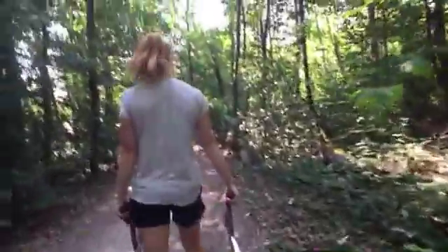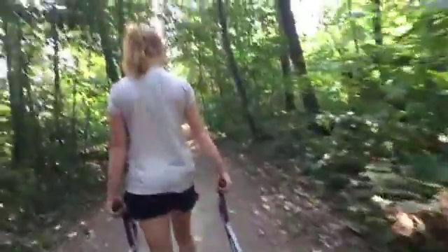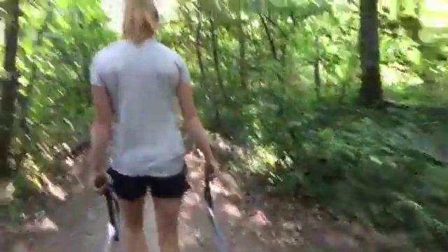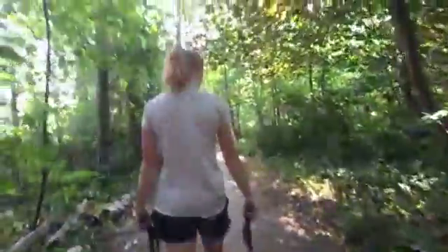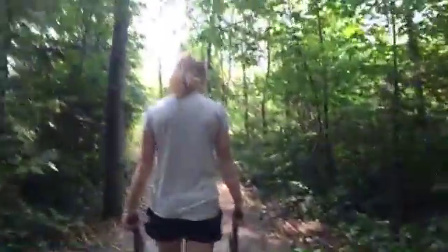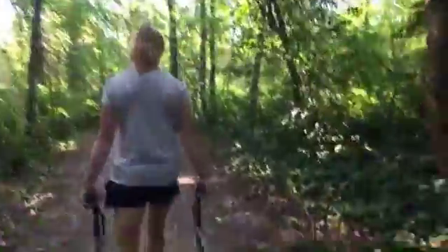The Trailrider's pretty easy to get used to and figure out. Like we said, it's pretty light, so especially in the front, it's a good position for a first-timer. And it's always good for people to bring friends. It keeps the conversation going, and it's a lot more fun with more people. From a rider perspective, I want the volunteers to enjoy it too. If there's more people, then you can spell each other off, and it's not about getting overtired.